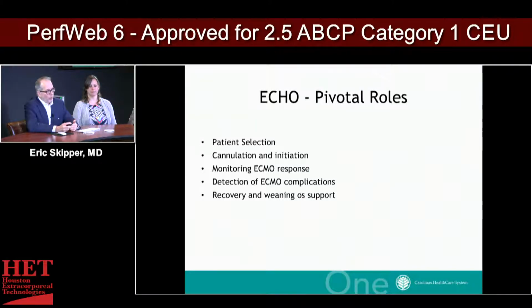If you're doing a femoral cannulation, you need a nice bicaval view to ensure that you're optimally placing your femoral venous cannula so that the tip of the cannula is a couple of centimeters up the superior vena cava so that you fully optimize drainage. Because in a recovery mode, you have to maintain appropriate drainage. It helps monitor ECMO response. It helps detect complications.